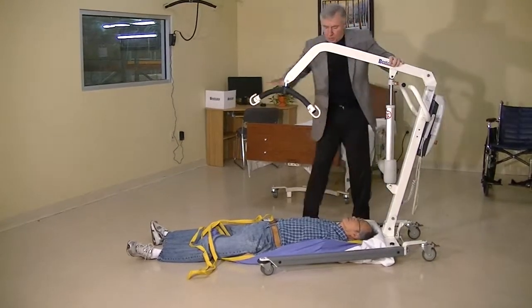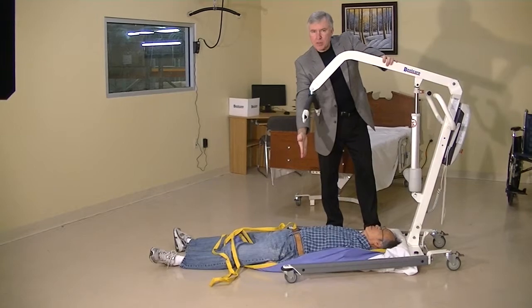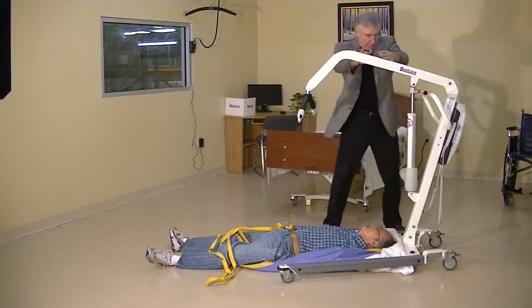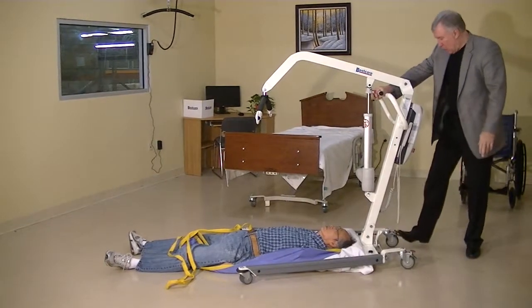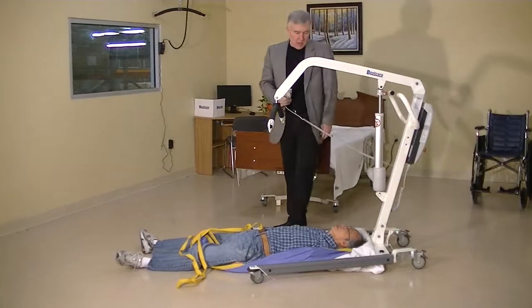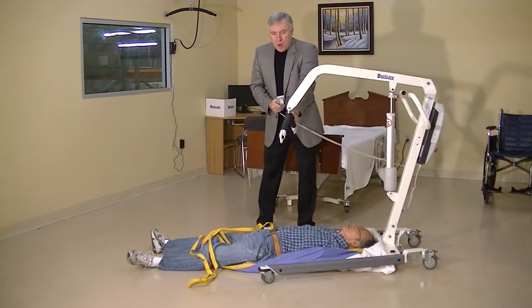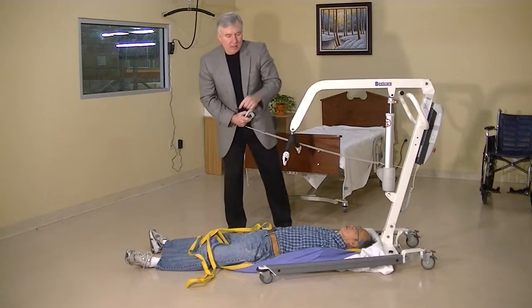So you can see that we can go from the head area and get the spreader bar right to about the middle of the person's body, which is where we want it. From the floor, we should lock the casters on the lift — we don't want the lift to move. Then hit the down button to bring the spreader bar low enough so we can connect the sling loops easily.